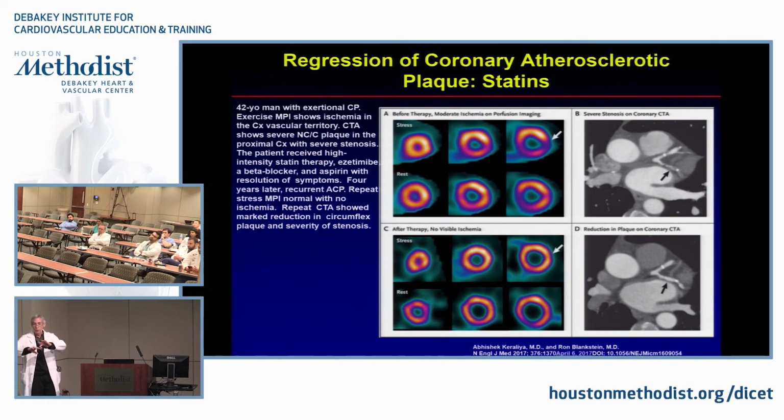Where you basically scale everything to a certain Hounsfield unit. Everybody's study is a certain Hounsfield unit. Right? And that could be easily done, just like we do in nuclear. I mean, every study is scaled to a certain maximal count, right? Which then it's 100 counts as the standard. Same thing with CT. You could do that, and that would improve reliability.